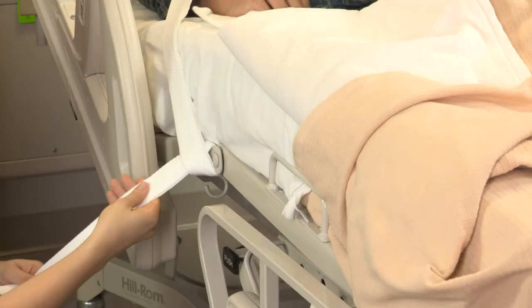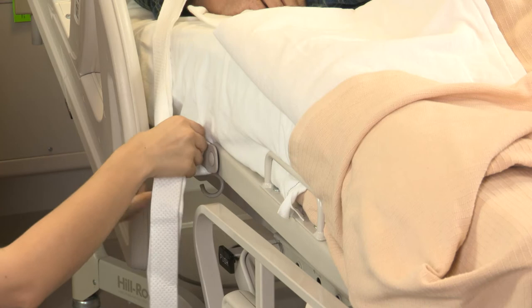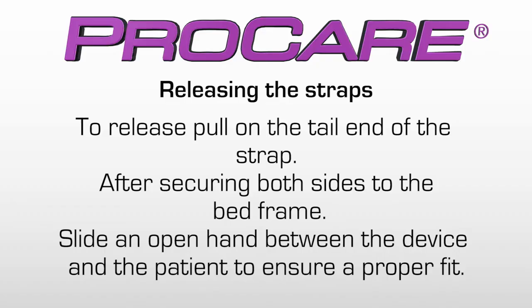Extend the straps and secure them in the desired location. Wrap the strap around a movable part of the bed frame at waist level. Bring the strap across, then behind the strap to make a loop. Bring the second strap through the first loop. Pull to tighten and tuck any excess strap out of the reach of the patient. Do not attach to the side rails.